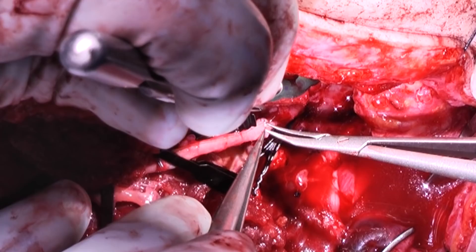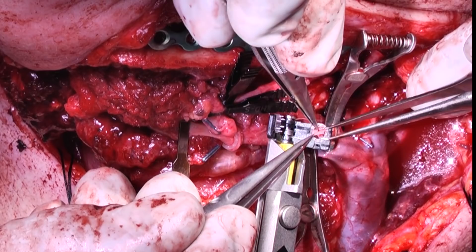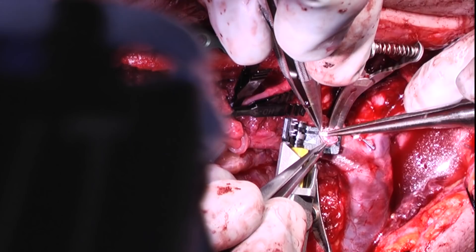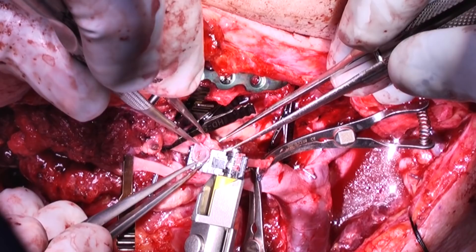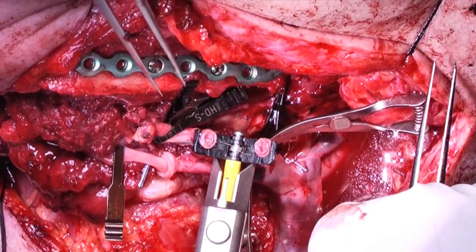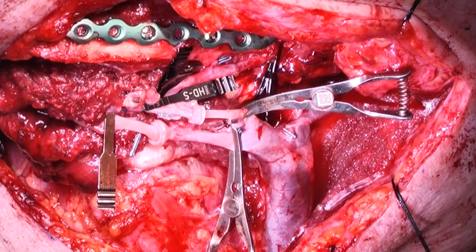After the arterial anastomosis is performed, the venous anastomosis is typically performed with the help of a venous coupler. An appropriately sized coupler is chosen — selecting one slightly smaller than the diameter of the vein is usually effective to ensure minimal tension. The vessel ends are pulled through the coupler and impaled over the pins on each side. Since the portions of the vessel lateral to the pins remain external to the anastomosis, the inner edge of the vein can be grabbed. The anastomosis is irrigated with heparinized saline, the coupler is closed, and a mosquito is used to crimp it to make sure it is tight.